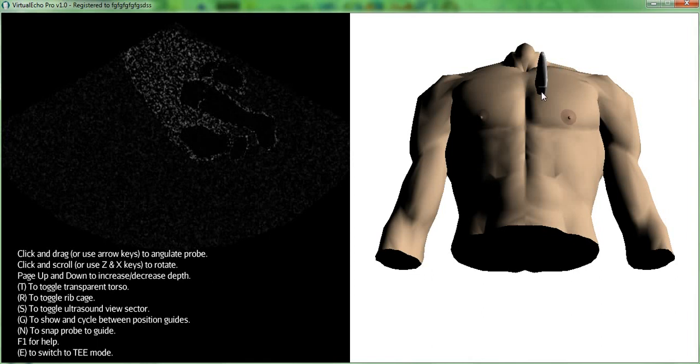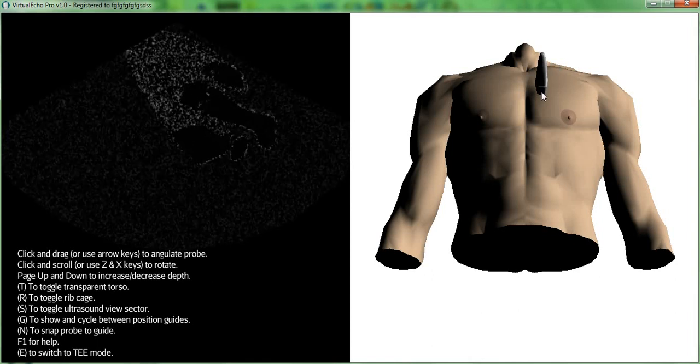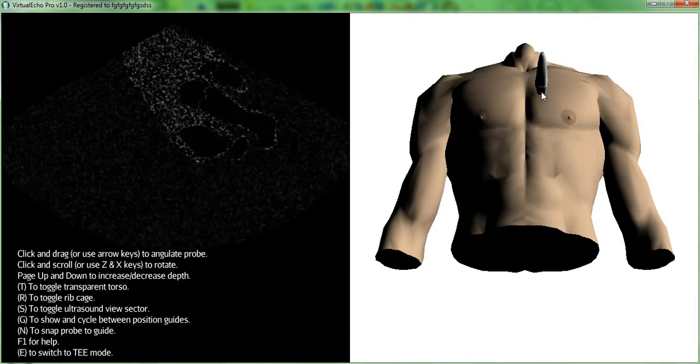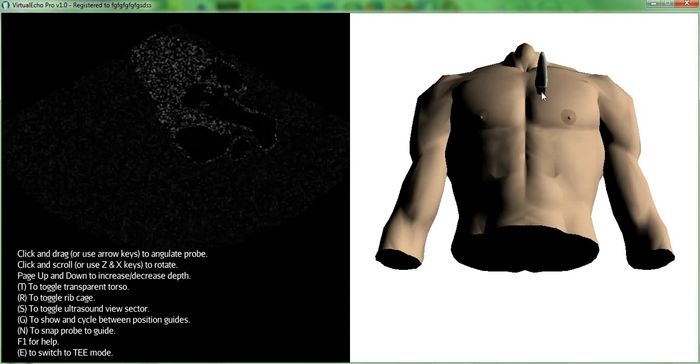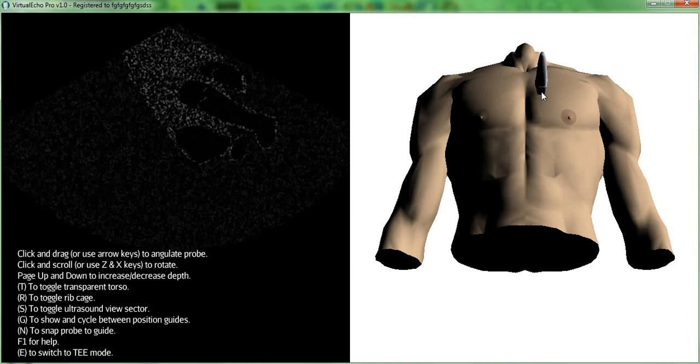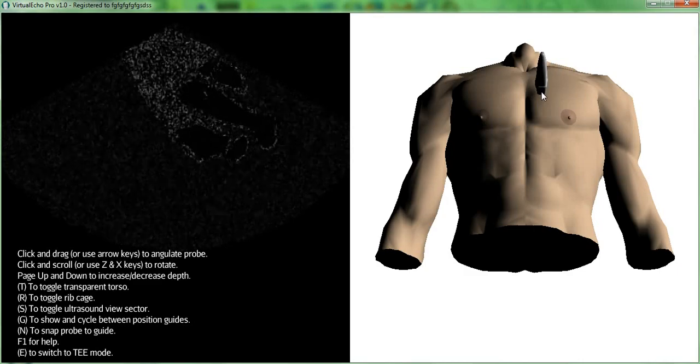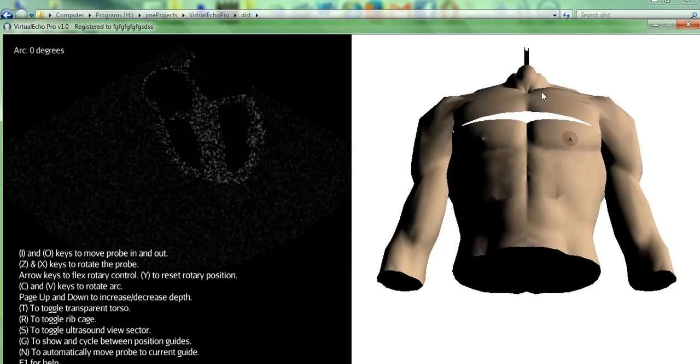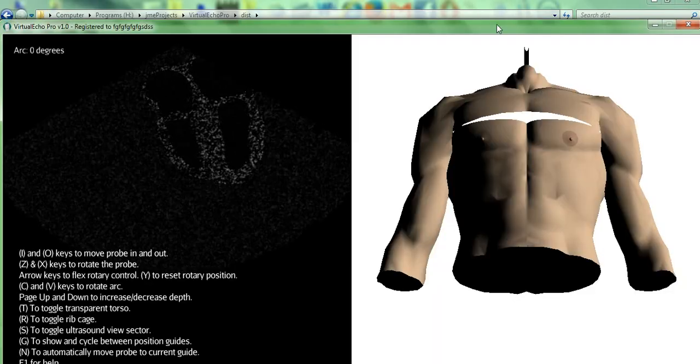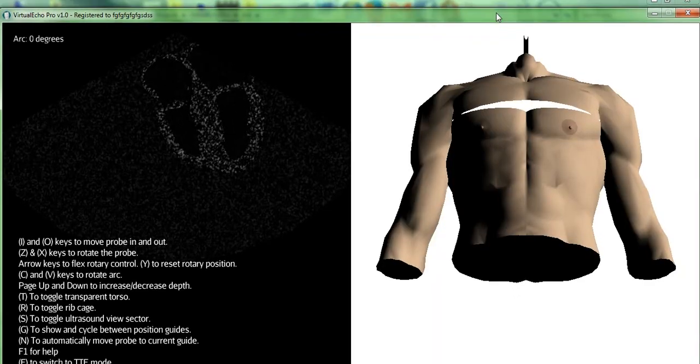When you first open Virtual Echo Pro, you'll see the same start screen as the Free Edition, but when you press the E key, the program will restart in the transesophageal mode.